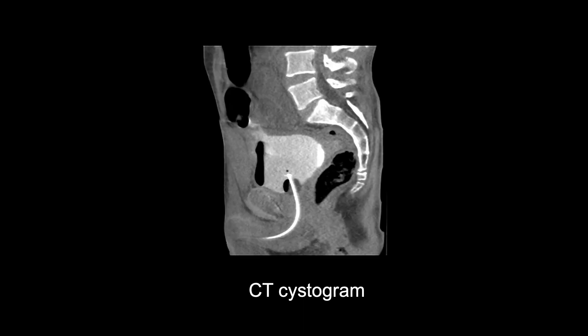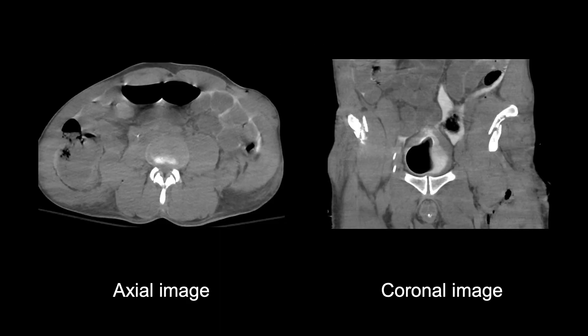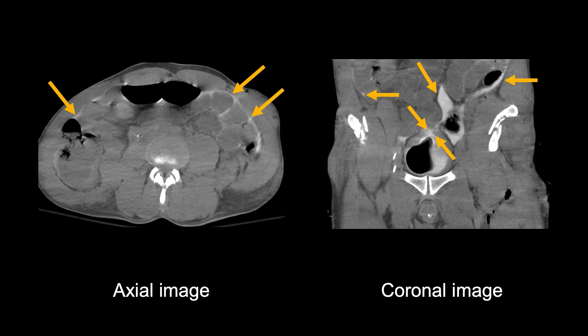A CT-cystogram was then performed. Filling the bladder with contrast allows us to see the characteristic location of the injury at the bladder dome, where contrast will leak into the peritoneal cavity. The appearance of bright contrast surrounding small bowel loops is diagnostic of an intraperitoneal rupture. On the coronal image, we can also appreciate the defect where contrast is leaking out and surrounding the bowel loops.